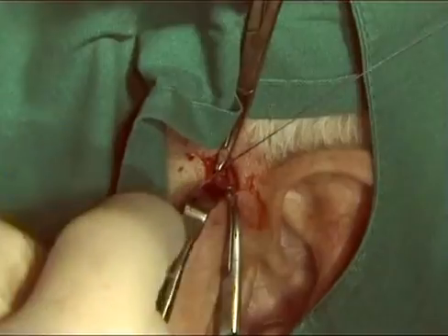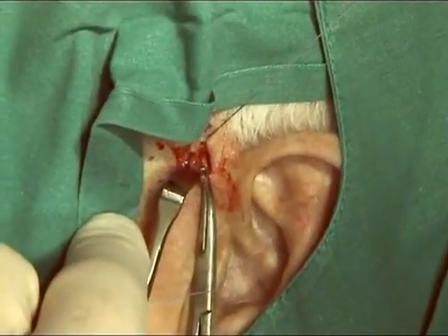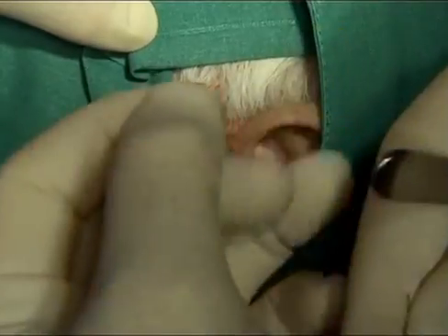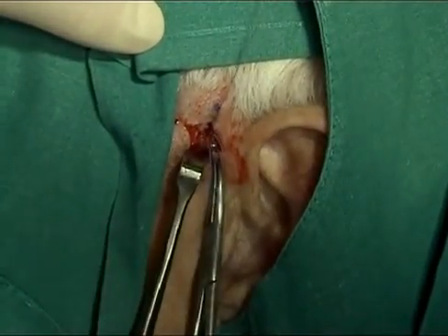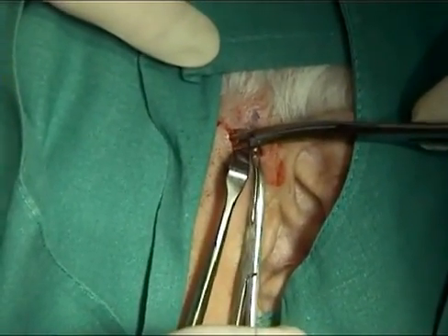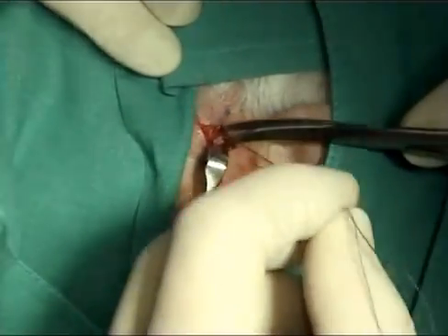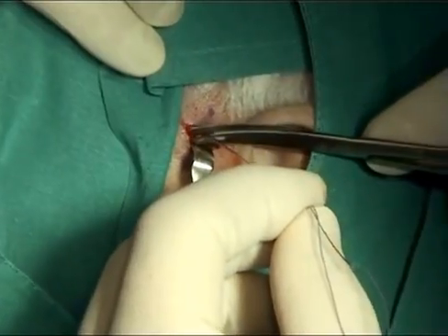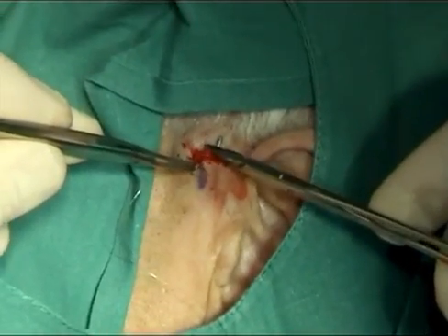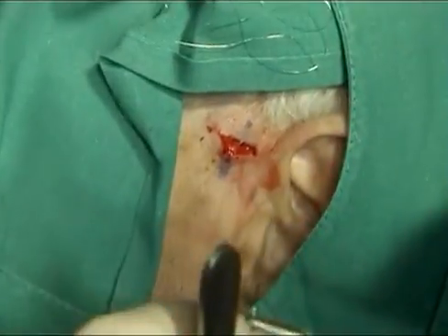The two arterial ends are then ligated with vicryl. And finally, the wound is closed with a subcuticular suture.